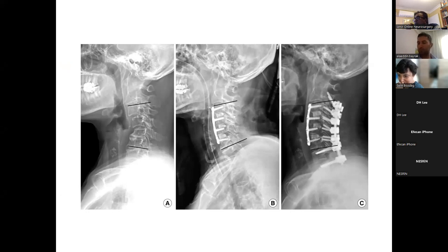If she was a patient with a normal T-score, no additional surgery would be needed at this point. However, we decided to do augmented posterior fusion to avoid complications associated with severe osteoporosis. In other words, VBSO could be useful for K-line negative cervical spondylotic myelopathy as well, and make very complicated procedures much simpler.